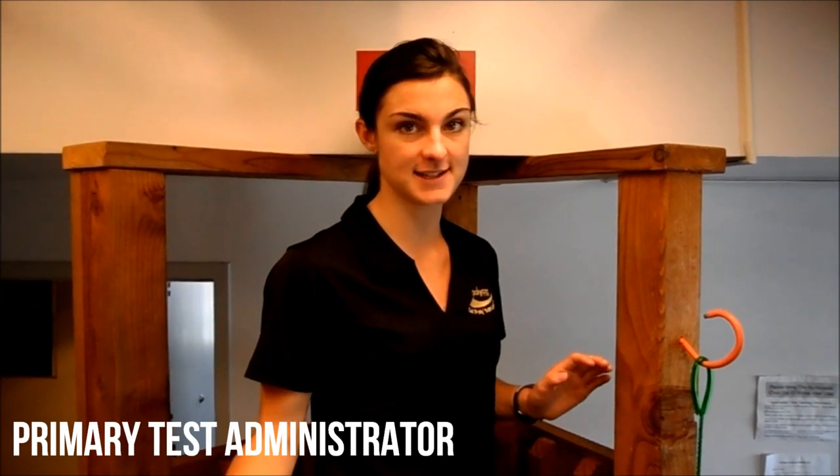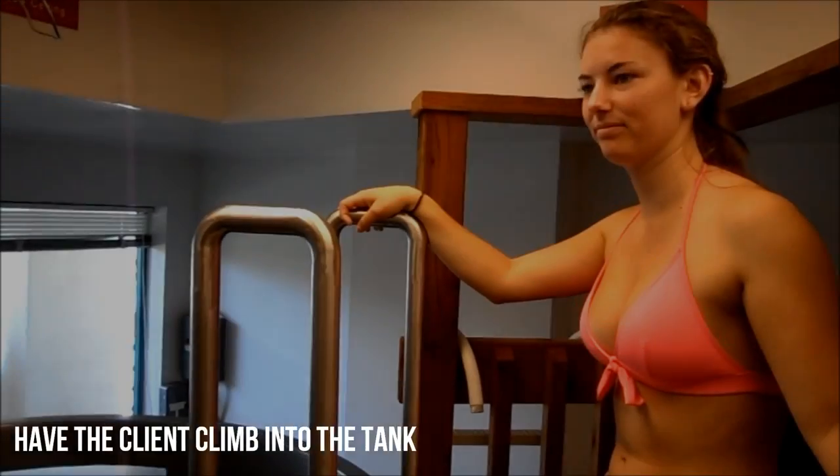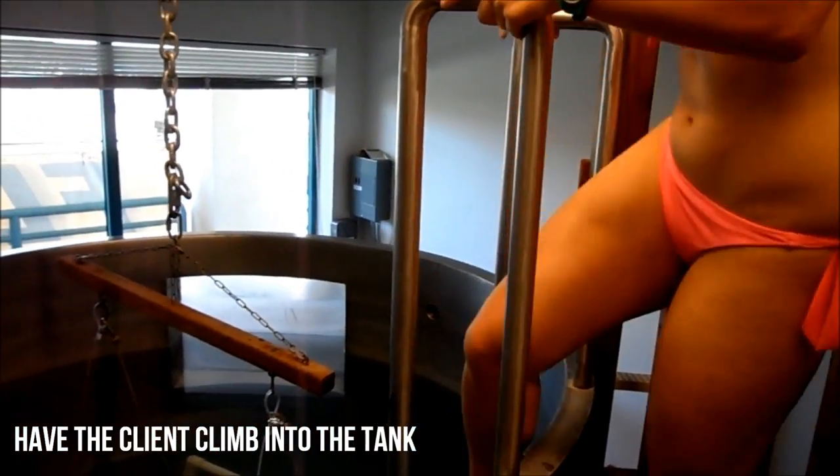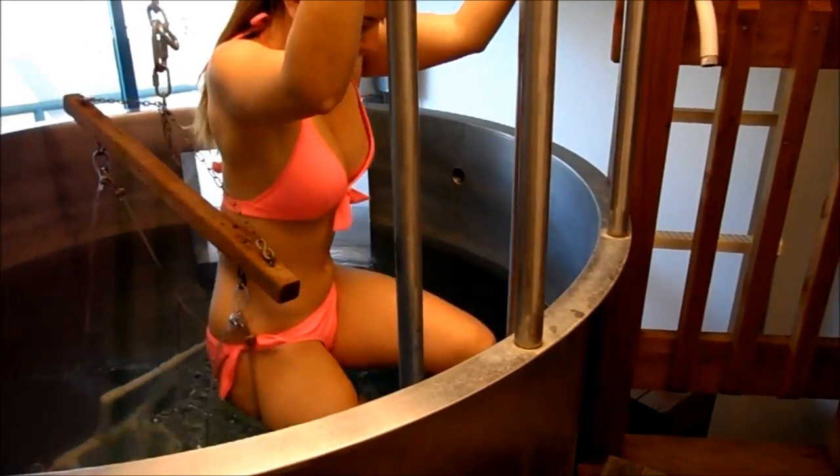The primary test administrator is going to stand right where I'm standing and keep an eye on the client. You'll have your client climb into the tank and get comfortable. Tell them to shake out all their bubbles when they're in there and take a seat in the chair.